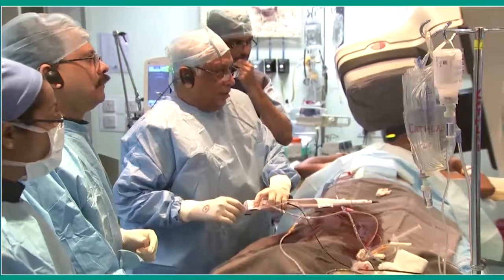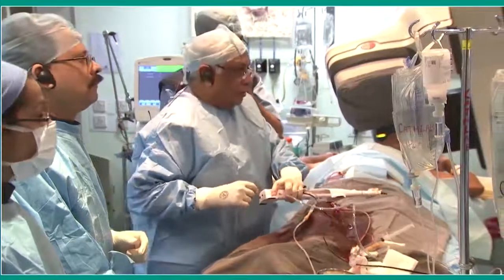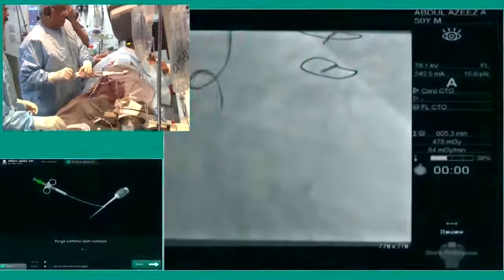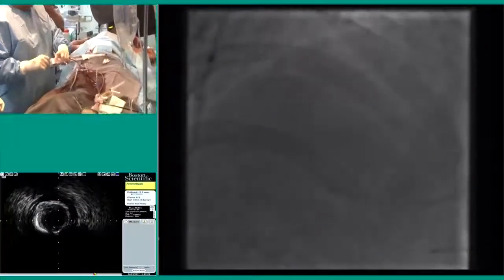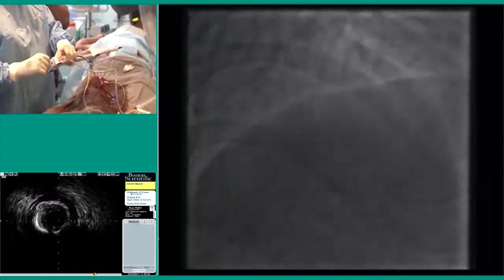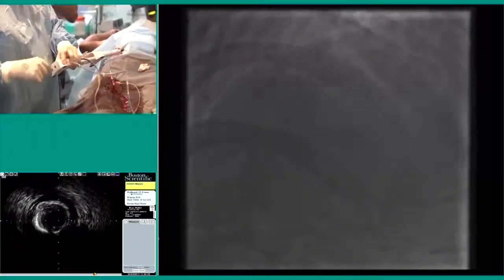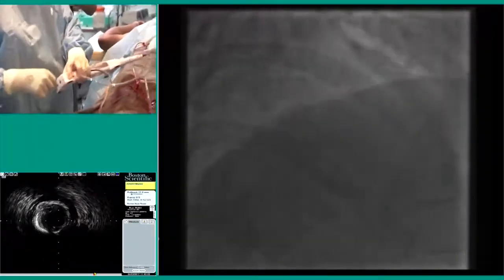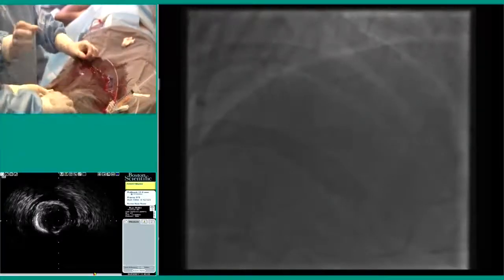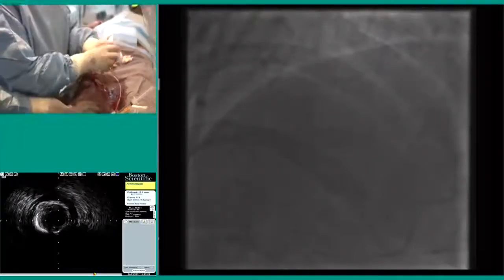So now this is another single-hand retrieval of the burr, as you will see. So this retrieval is again single hand. So all job done. Okay, BMW wire.